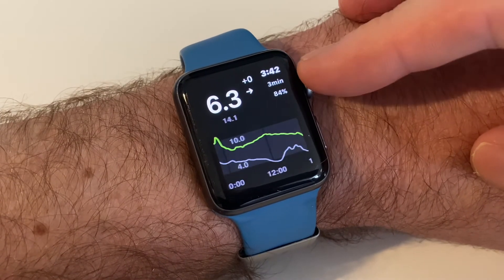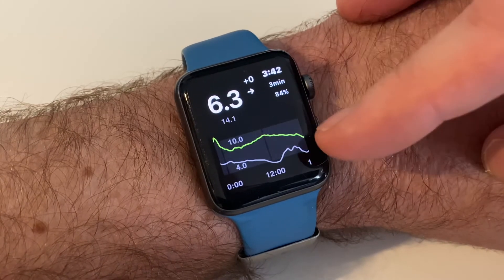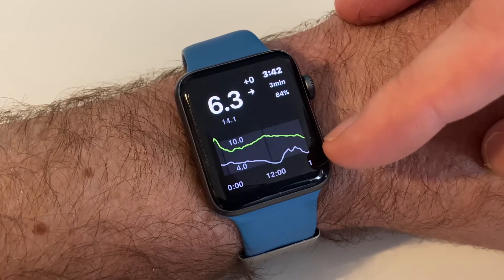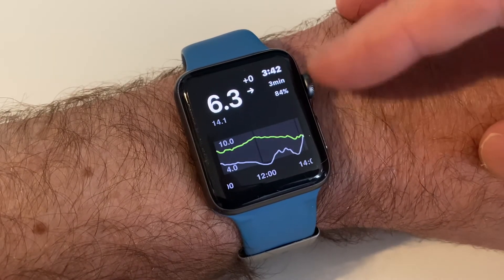I can scroll back in time and actually see what's happening. The grey little graph here is what happened yesterday, so I can compare and check my routine and see how I'm going.